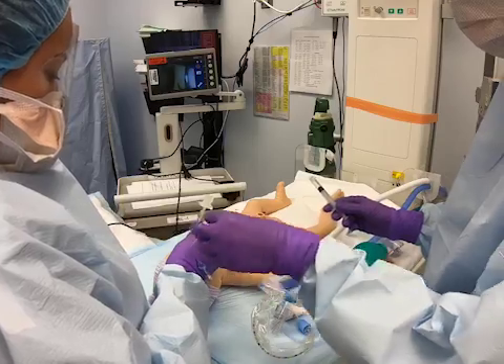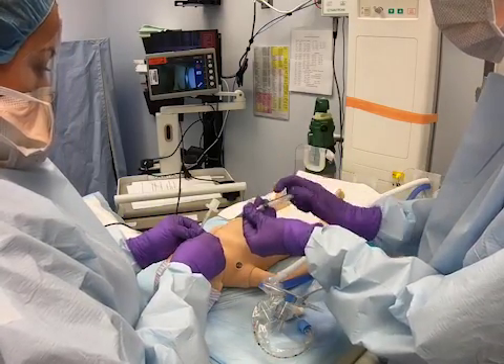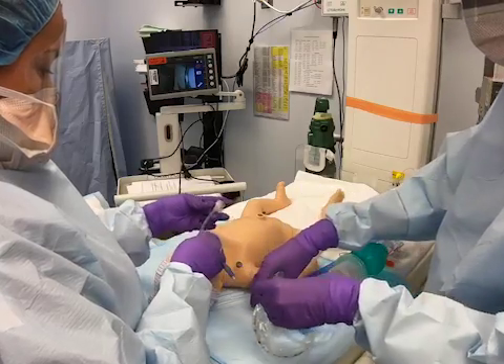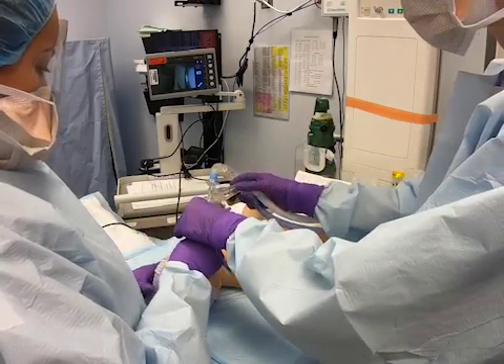Once the baby is intubated, inflate the balloon with one milliliter of air to minimize aerosolization of secretions. Then connect the endotracheal tube to the closed suction ventilator system.